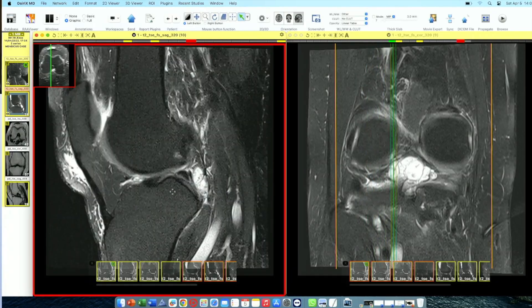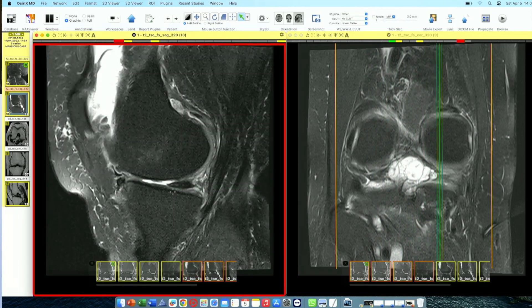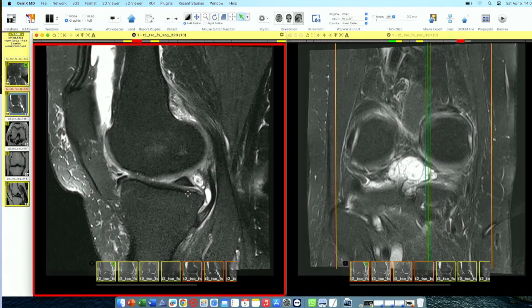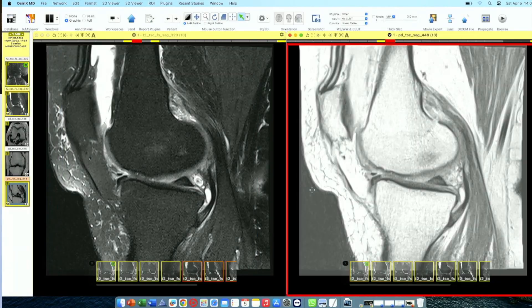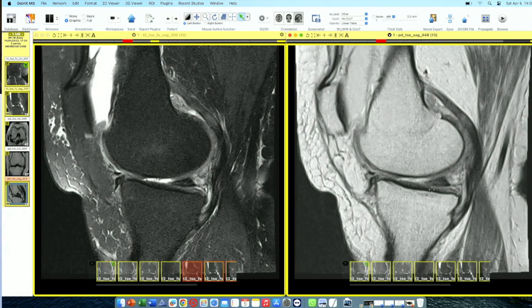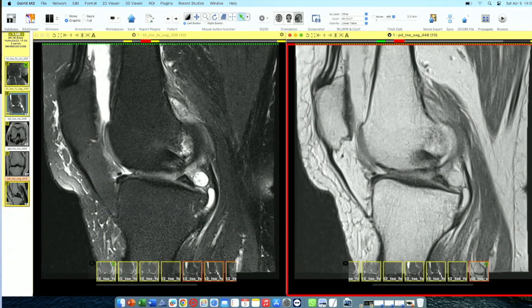The lateral meniscus is somewhat okay — there is some grade one signal. Now let's look at the medial meniscus. While scrolling, you can see there is a hyperintense signal extending up to the inferior surface. PD images are really helpful to look at these tears, and here you can see a horizontal signal extending up to the inferior surface — this is a horizontal tear. A horizontal signal is always a horizontal tear.